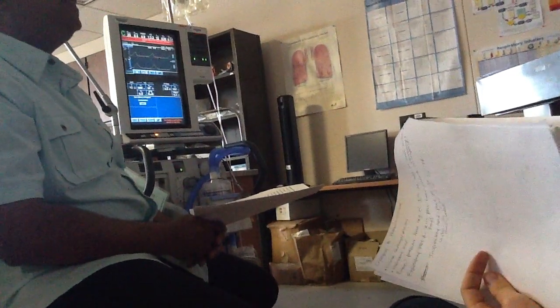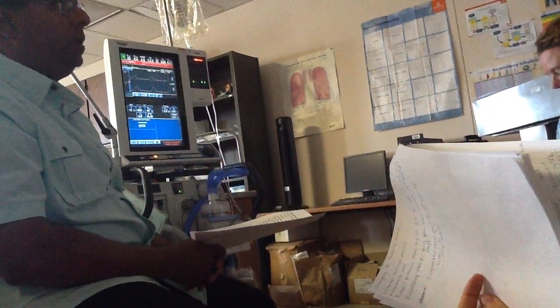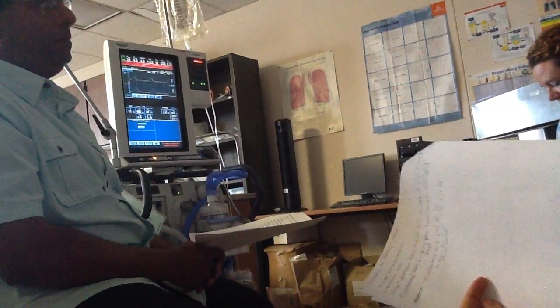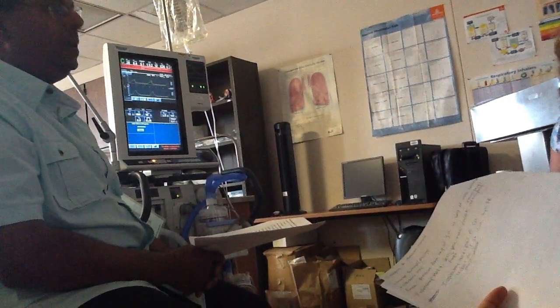If you don't have enough expiratory time, you can have auto PEEP. If you have too much pressure going into the lungs, you can have auto PEEP. If you have too much PEEP, you can have auto PEEP. Auto PEEP, you have too much expiratory time? Inverse ratio, yes. Too much expiratory time? Not enough.